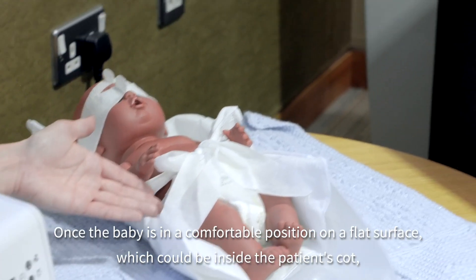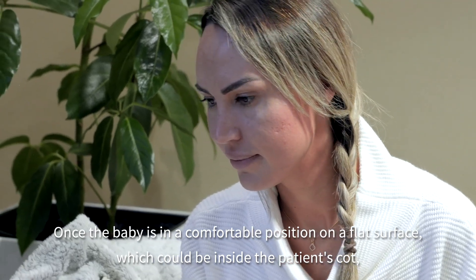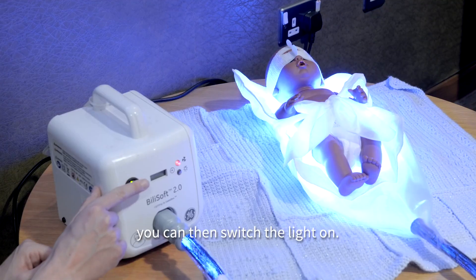Once the baby is in a comfortable position on a flat surface, which could be inside the patient's cot, you can then switch the light on.